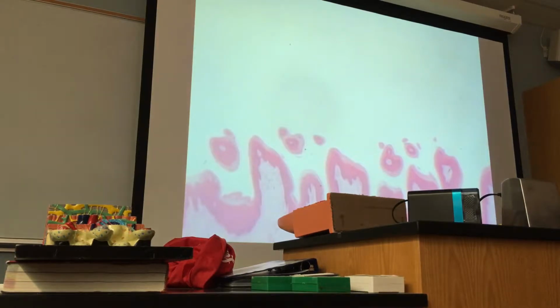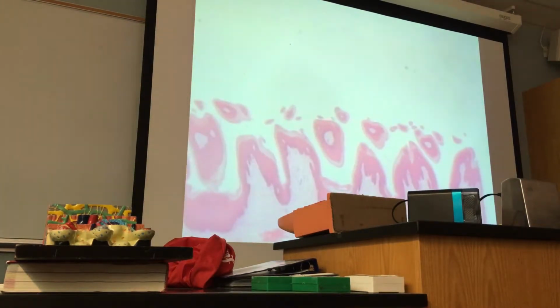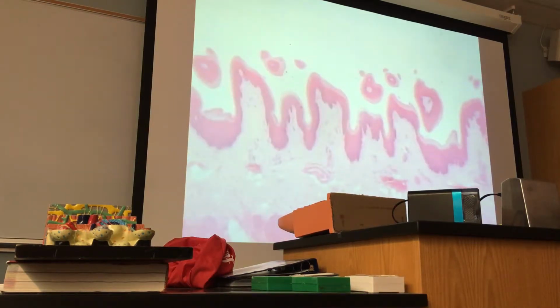And look here, the top layer is dead cell layers, keratinized. This is pointed. Here, dead cell layers. Are those filiform? These are filiform. Yeah. These are all filiform papillae. Okay? All right. So you have seen filiform.